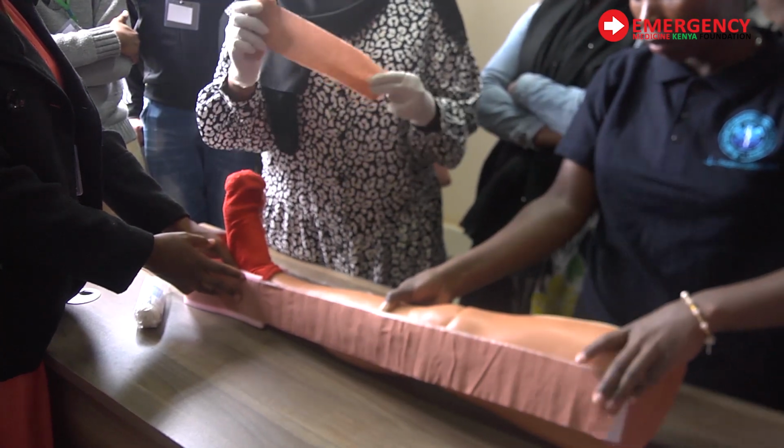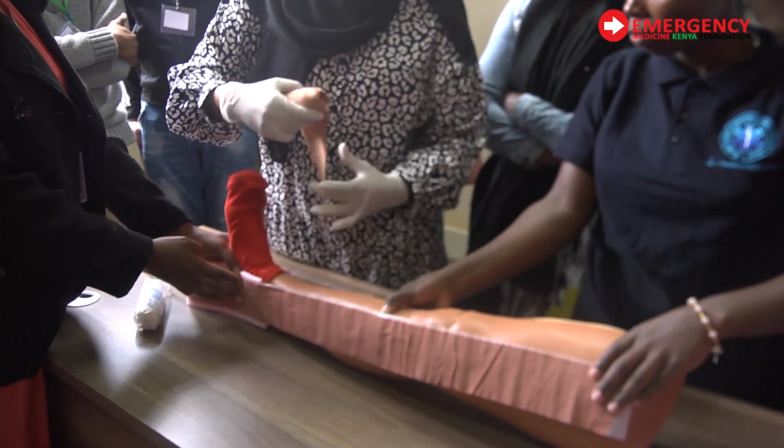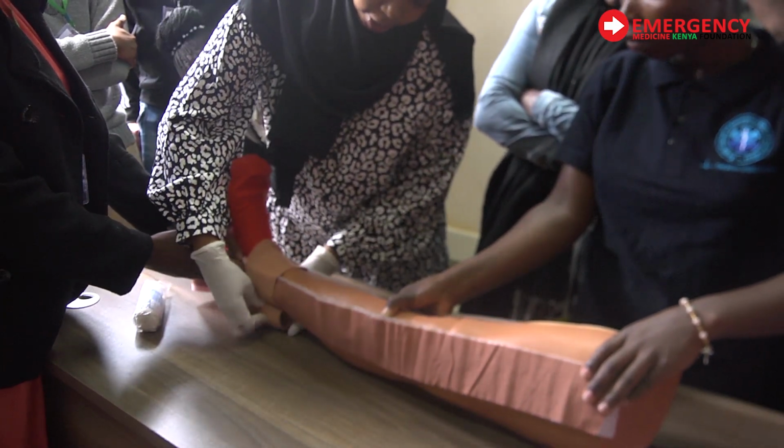So what do you do? You tie at the malleolus, okay? Make sure the malleolus is here. That's where I start my tying knot. So me, I go above like this.